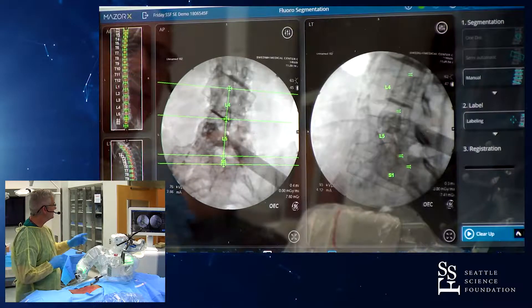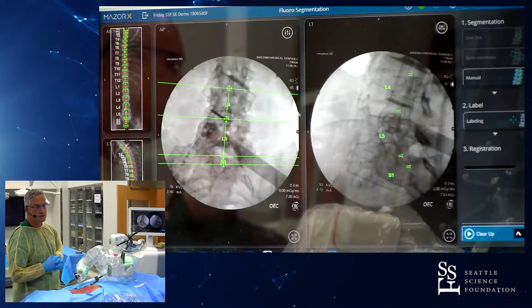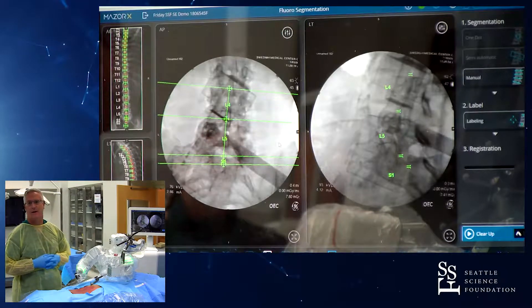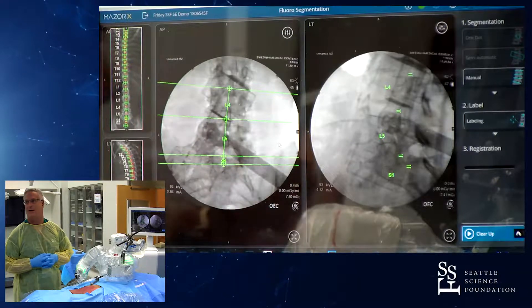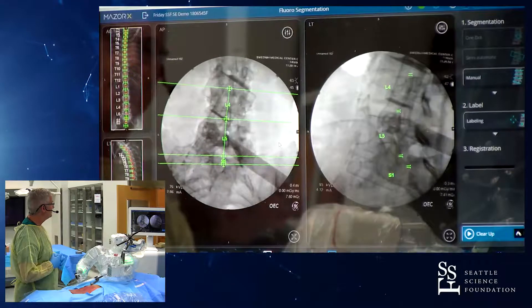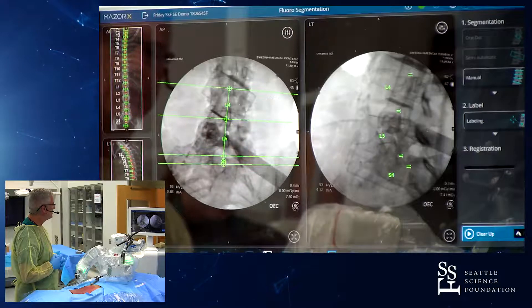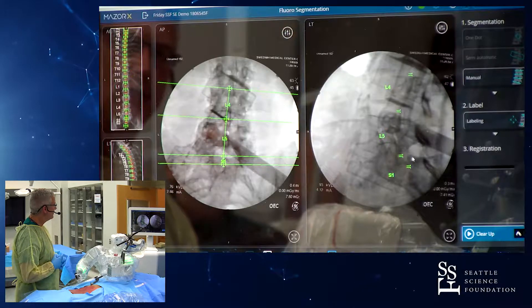We've done segmental registration — you can see this on the screen. This provides us with a powerful tool and flexibility so that we can work at each individual level. Here we have the segmental registration and you can see L4, L5, and S1. We've defined the posterior aspect of the vertebral bodies, and on the lateral we will mark out the spinal canal.